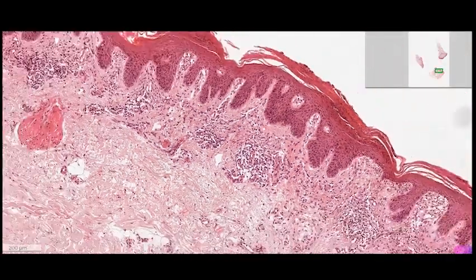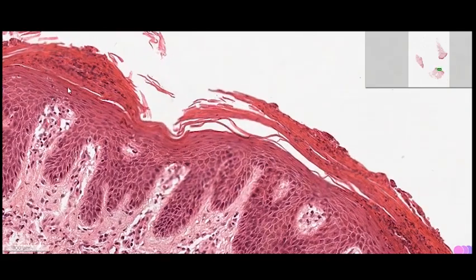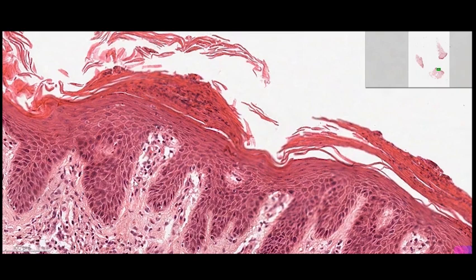Okay, go to the epidermis, which contains the main pathology. You will find nice parakeratosis with neutrophils. I will go to higher power to show you. Look, we have an acanthotic epidermis, thinning of the suprapapillary portion, no granular cell layer. Then you will find a thin layer of parakeratosis. Then you will find neutrophils. These dirty blue ant-like structures are neutrophils. Neutrophils, when they go up in the stratum corneum, become crushed or smudged. Okay, then a layer of parakeratosis, so we have a nice sandwich here.